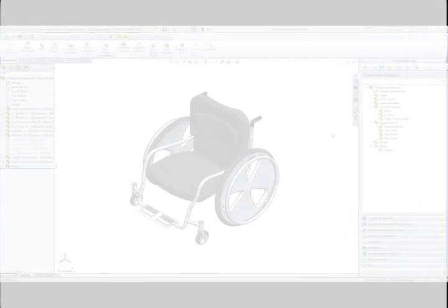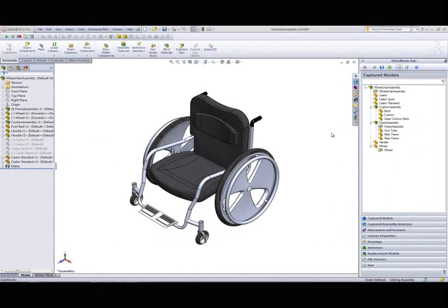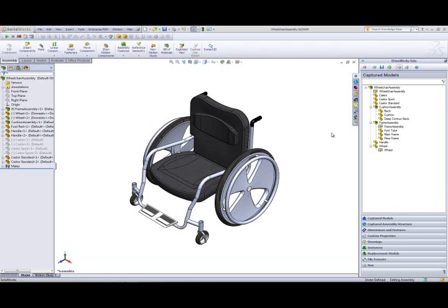This is a video from one of our design and configure example projects using DriveWorks Solo. This particular one shows you how you can configure a custom wheelchair. All the design rules and know-how for designing the chairs have been set up in the project and are driven by the requirements and values entered on the forms.